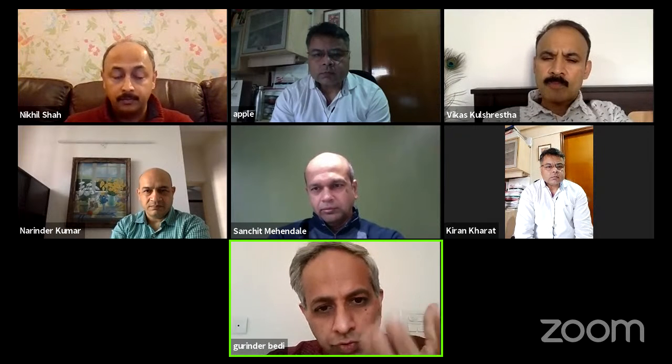Agreed. I think the claw plate is definitely some sort of an improvement on that. But combine your claw plate with some cables which go through the plate, that is really required. So one or two of my colleagues like the claw plate, and that's what they use. The other good thing which has come out is that clip which you put on to the plate.